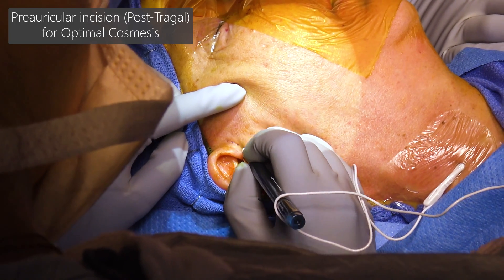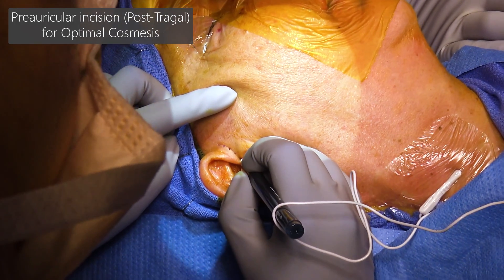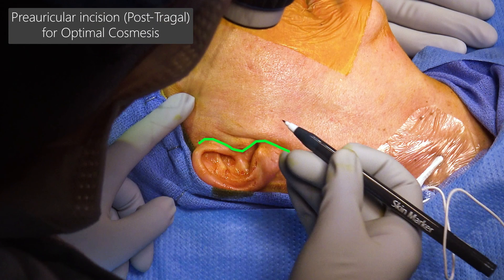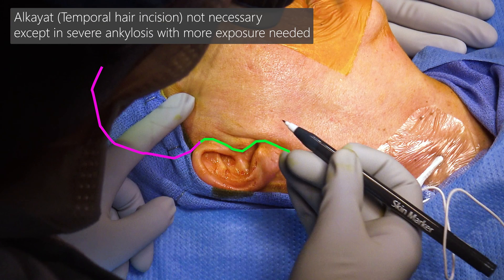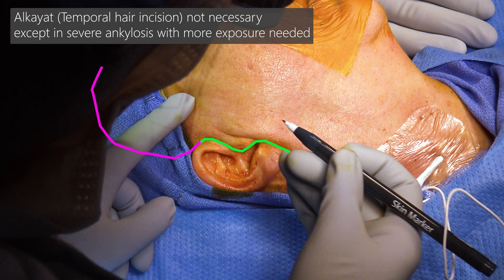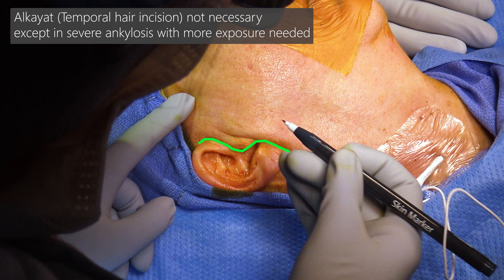Avoiding facial nerve injuries is a key step to this procedure. The incision is designed within the preauricular skin crease and then taken posteriorly behind the tragus for optimal cosmesis. An Al-Kayat or temporal extension is not necessary in all cases, but can be when dealing with severe ankylosis or difficult access.